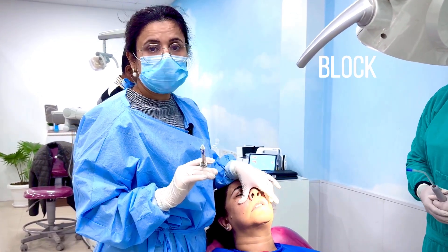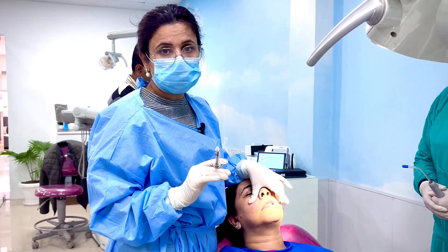To remove the third molar, you will also have to give a Greater Palatine block.